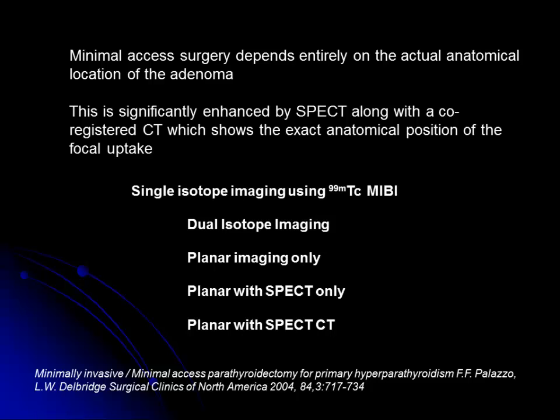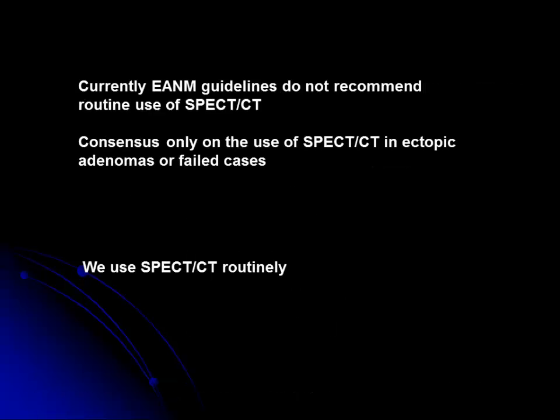Otherwise, with planar imaging it's difficult to show the depth. You can only localize the site. So I think that's why SPECT CT is very important for localizing and directing the surgeons. Currently, EANM guidelines do not recommend routine use of SPECT CT, with consensus only on its use in ectopic adenomas or failed cases.